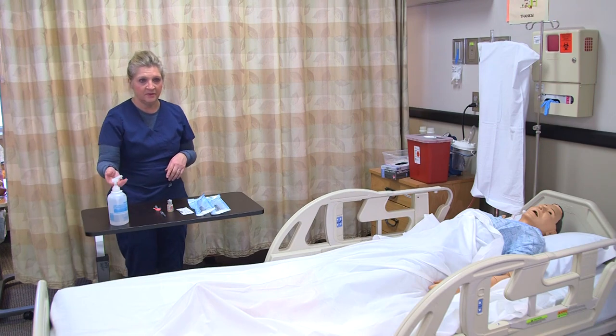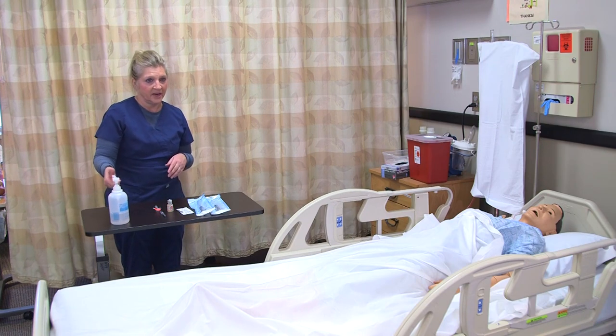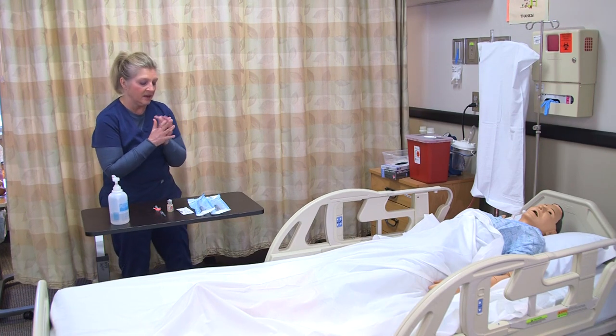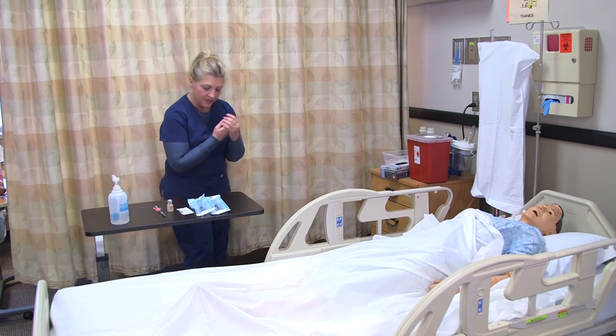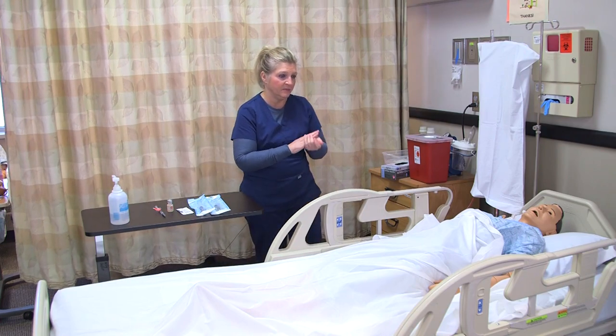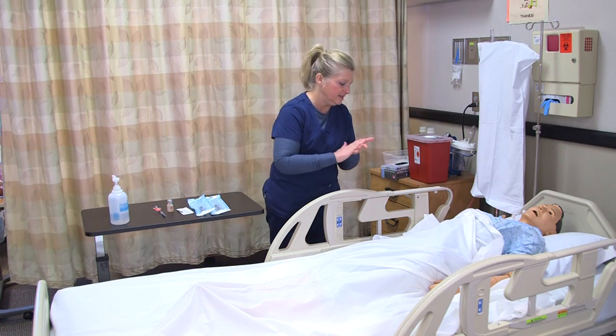I introduced myself, I'm going to wash my hands right now, and then I'm going to go over here and verify my patient's identity.